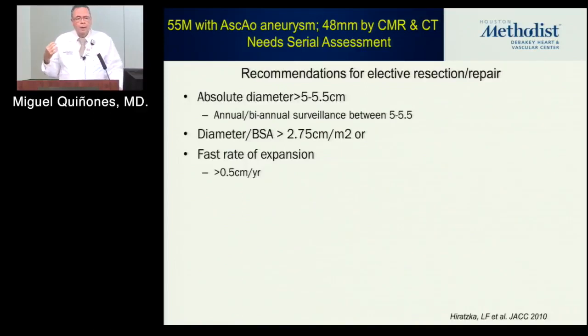I mean, we do great work here. That doesn't mean that everywhere else in the world people are as careful. So it's very important when you're in practice, if you're going to follow these things, that you have a comfort with whatever technique you are using and the people who are imaging and measuring, because a change of 0.5 per year could be a red signal for doing something about it.